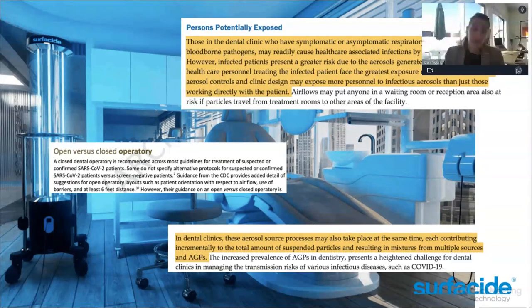A little bit about open operatory patients that are exposed. You all know this. I know this is what this whole event is about, really. But people that are coming into the environment are the biggest problem and the biggest reason that environments become not sterile anymore. I say this even in an OR environment. You can measure the air quality, go into a sterile OR and say there's no particles in this room and everything is good. But once you look at the surfaces and once people come in, all of a sudden those numbers go off the charts again. And this is where UV can come in to be a supplement to what you are already doing.